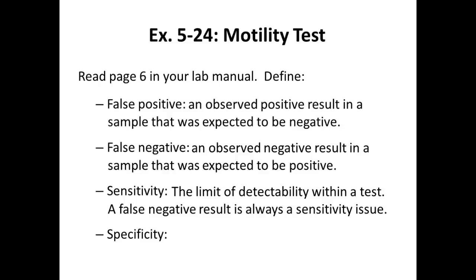It has to be at a certain level for that test to detect. So as you get longer in your pregnancy, that hormone level goes up, right? So once you've reached a certain point, you may be within that detectable range, okay? So a lot of tests have a sensitivity range where you can actually see positive results, and not end up with false negatives. Because even though it may be there, it may not be detectable. You can't see it, right? Or the test cannot let you know that it's there. Does that make sense to you guys?